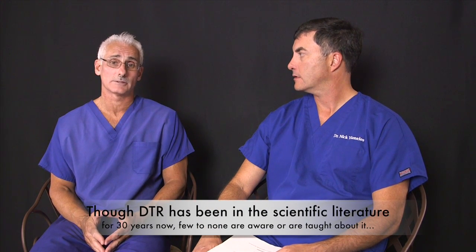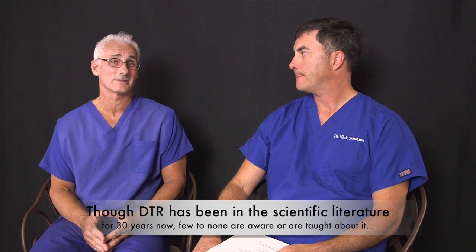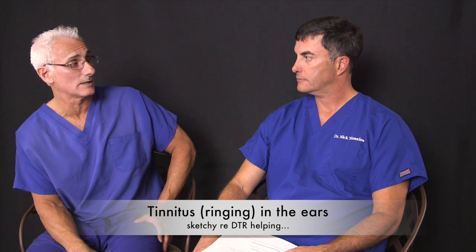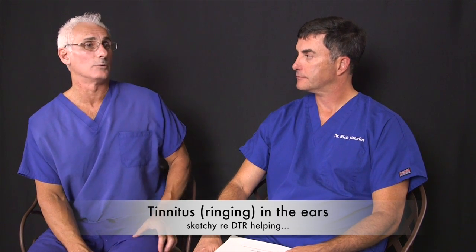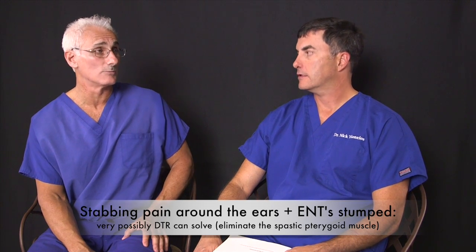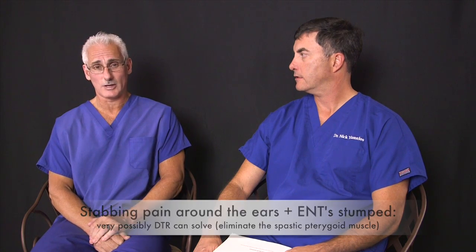Tinnitus is a little harder to get resolution from disclusion time reduction therapy. It doesn't always help it. I would say it's 50-50 that it might help it. Yeah. So if patients are advised that it may not help them and they still want to go through it, they're choosing to go through it for the sake of hoping to lessen the tinnitus. But there isn't a way to know, as would, let's say, getting tired chewing. That's something that responds very readily to disclusion time reduction. Sure. Because that's a true muscular issue, as opposed to tinnitus, which is very hard to qualify, where it came from. Neurological, vascular, something, yeah.